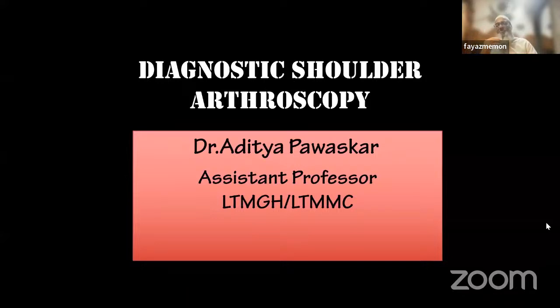But if it is a subacromial portal, I require some space wherein I can keep the deltoid away from my working place. So there I use this arthro pump. And earlier when we were learning, it was too high a pressure that we used to use, 80, 100, whatever. But now we start at 35, maximum that we require, if at all, it goes up to 45, otherwise 35 is good enough.